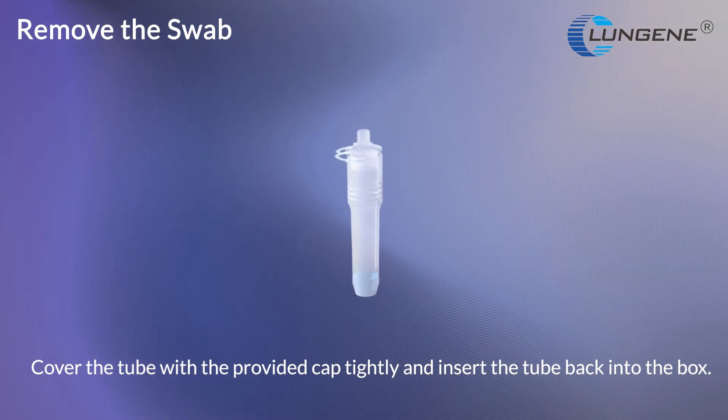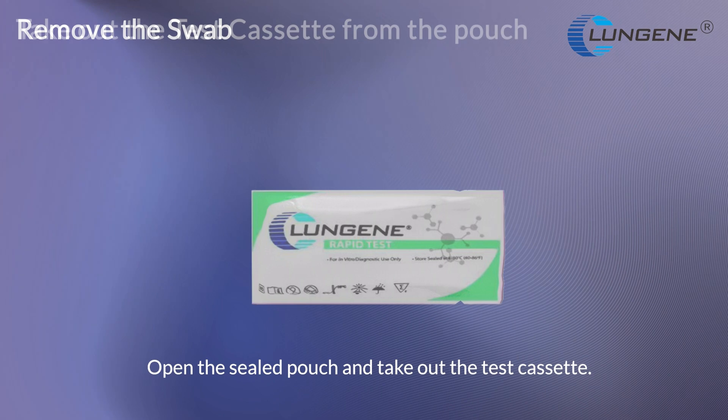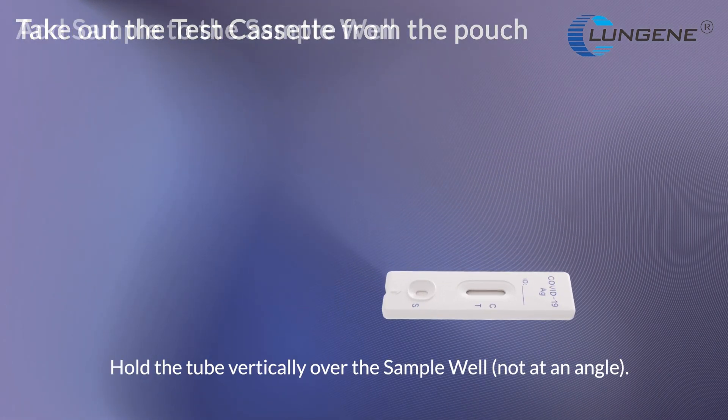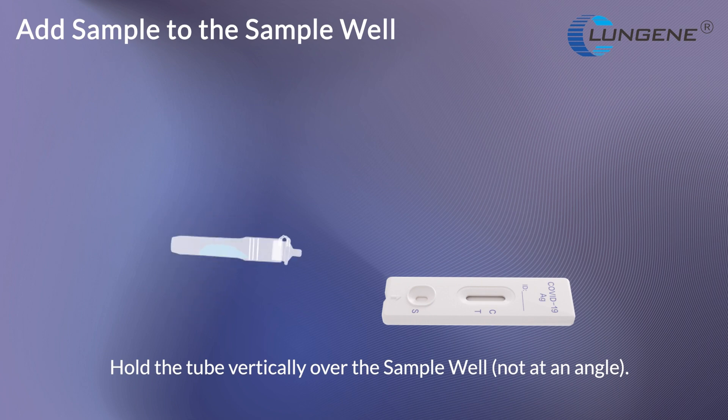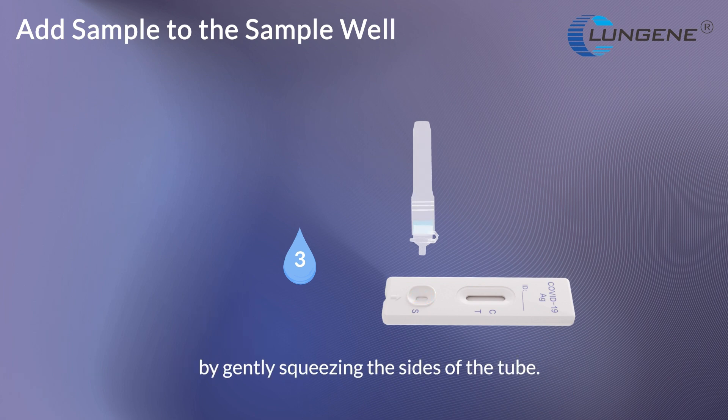Cover the tube with the provided cap tightly and insert the tube back into the box. Open a sealed pouch and take out a test set. Hold the tube vertically over the sample well, not at an angle. Add 3 drops from the tube into the sample well by gently squeezing the sides of the tube.